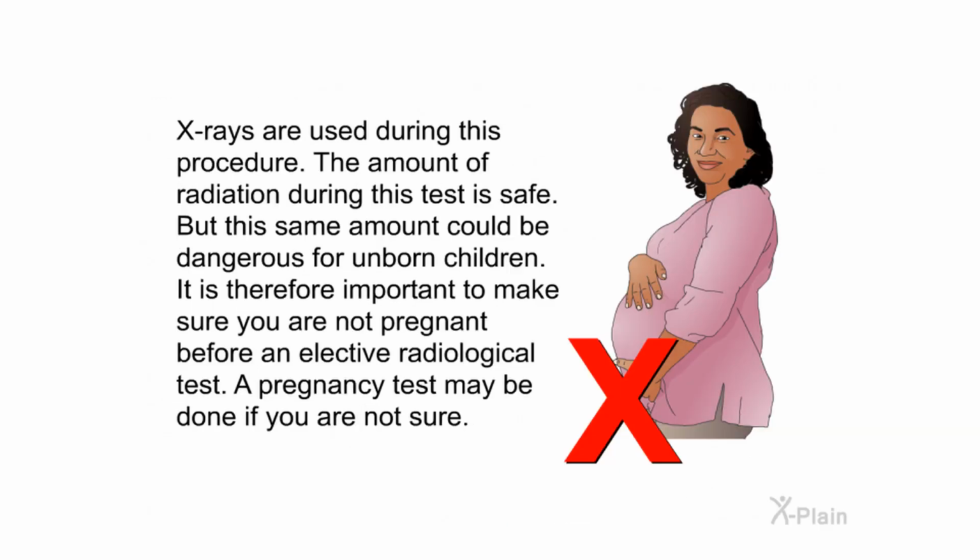X-rays are used during this procedure. The amount of radiation during this test is safe, but this same amount could be dangerous for unborn children. It is therefore important to make sure you are not pregnant before an elective radiological test. A pregnancy test may be done if you are not sure.